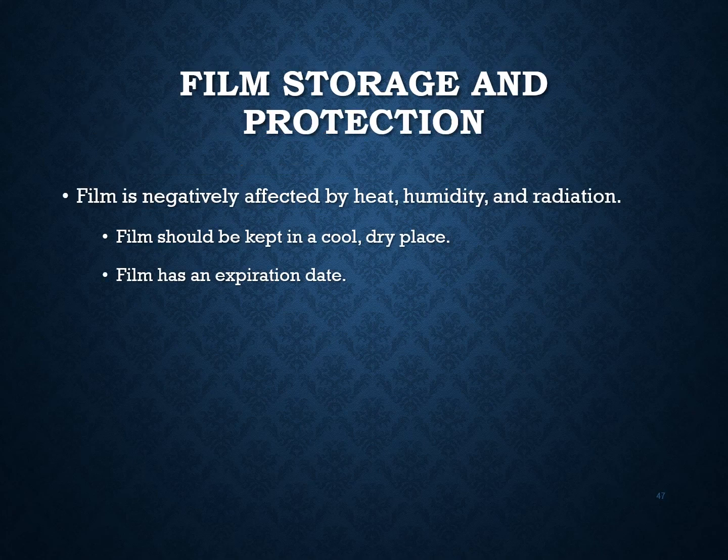All right, so film is negatively affected by heat, humidity, and radiation, of course. Film should be kept in a cool, dry place, and it's important to remember that film has an expiration date because those crystals aren't going to stay in that solution in that balanced state forever. Eventually they're going to shift or move, and then the radiograph that we take won't be diagnostic, and we will have exposed our patient unnecessarily, and that would be very bad.